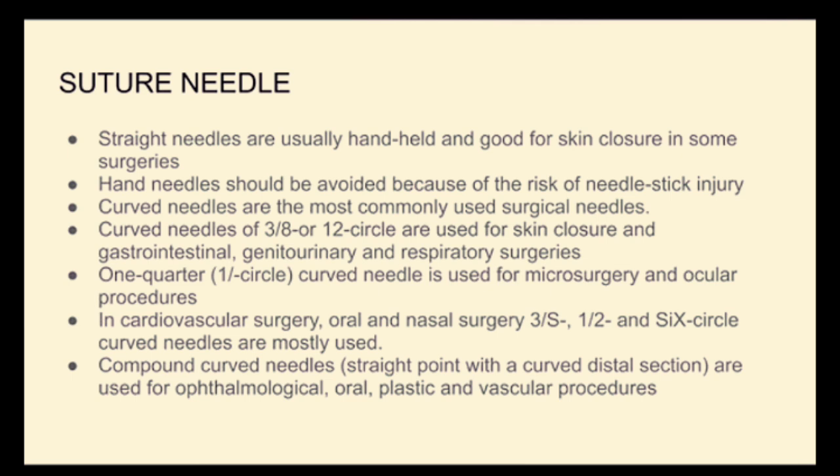So straight needles usually are handheld and they are good for skin closure in some surgeries. However, they should be avoided because of risk of needle stick injury because you're holding it. Curved needles are usually more commonly used, and the commonest ones used are the 3/8 circle.